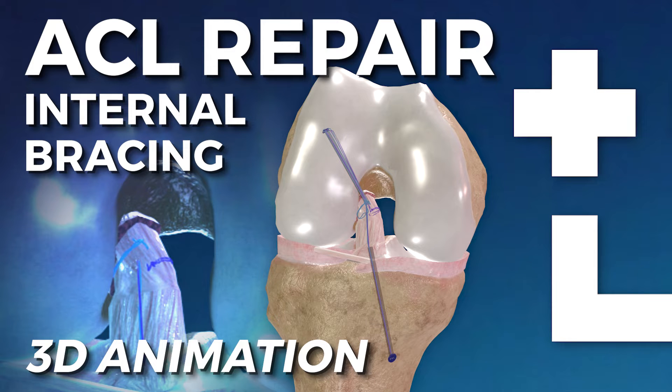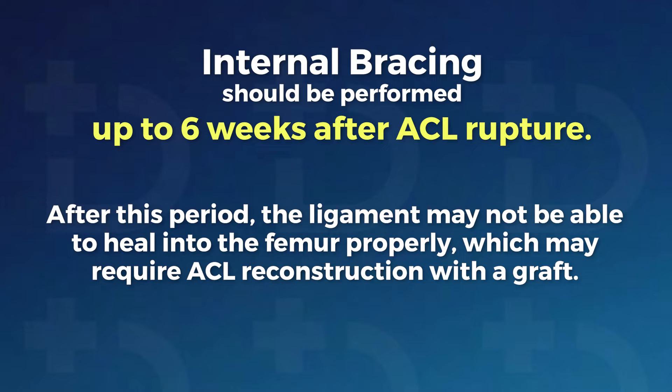ACL Repair with Internal Bracing. Internal Bracing should be performed up to 6 weeks after ACL rupture. After this period, the ligament may not be able to heal into the femur properly, which may require ACL reconstruction with a graft.